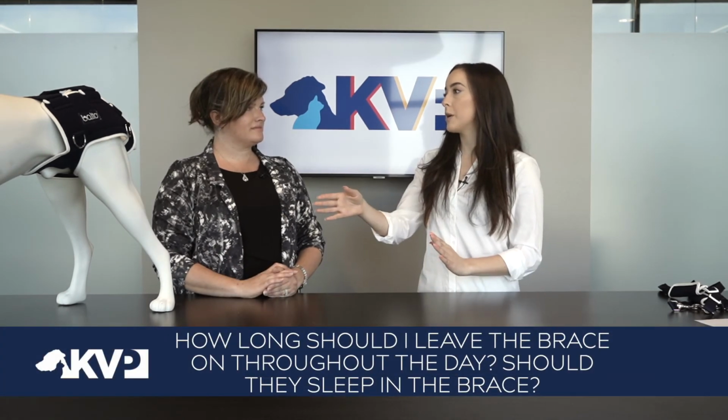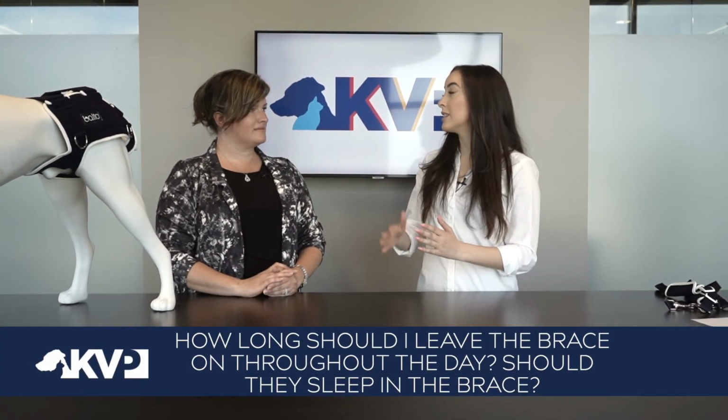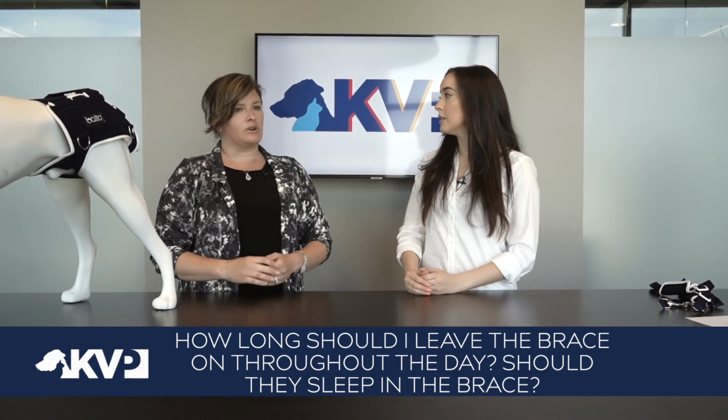So how long should I leave this brace on my pet throughout the day? And can they also sleep in it? So we don't recommend that they sleep in the brace. You can leave it on for upwards of 12 hours. However, we don't suggest that you start there. With all of our Balto braces, you want to start with 30 minutes the first day, move up to an hour, and then up to 12 hours on and 12 hours off, because we still want the skin and coat to have a break and be able to breathe.